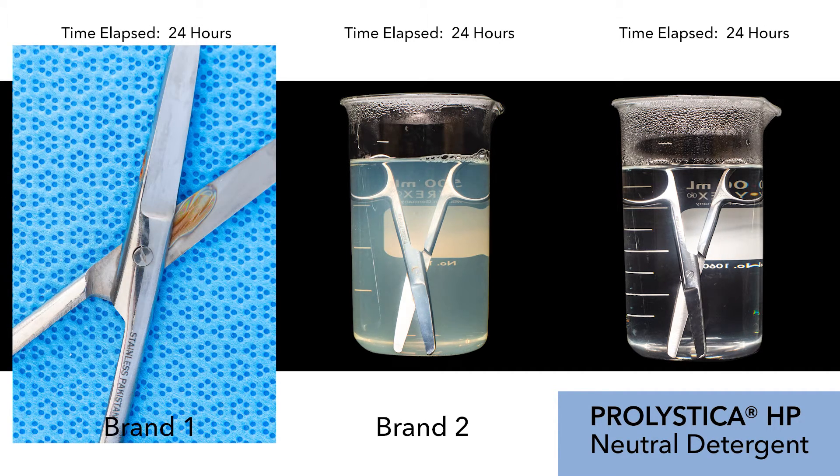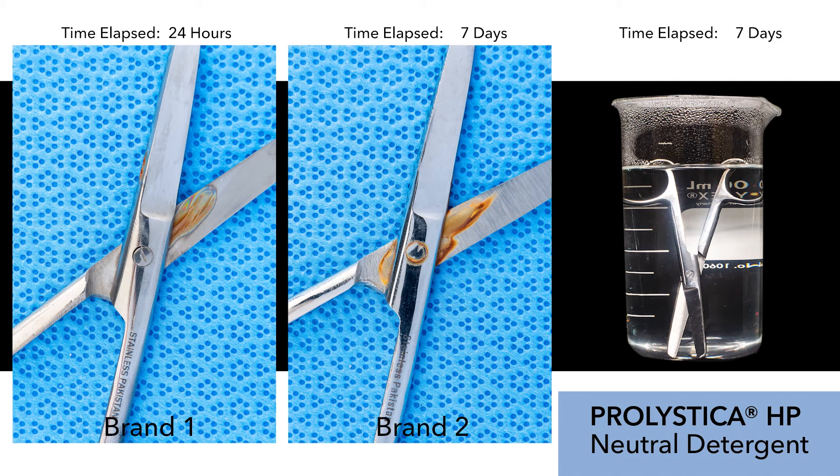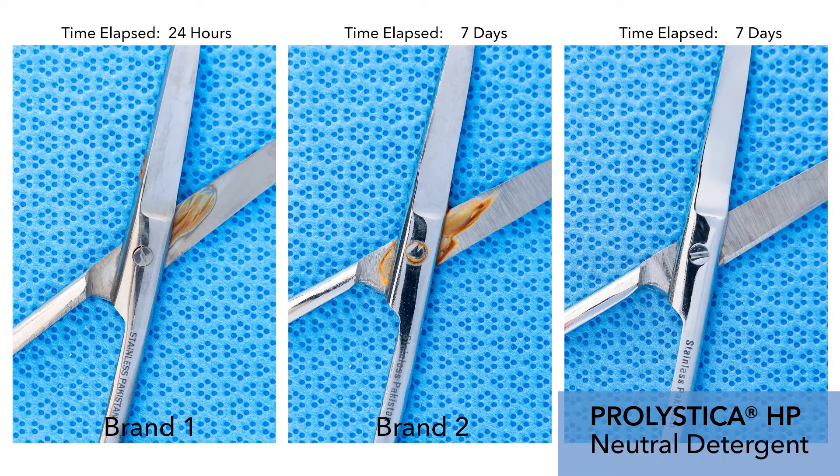Over a period of one day, you can already see the chemistry on the left has caused notable instrument damage. After one week, you can see the beaker in the middle has caused visible damage to the instrument. Notice how the beaker with Prolistica has caused no visible damage to the instrument after soaking for one week.